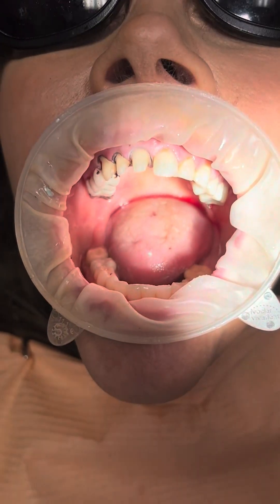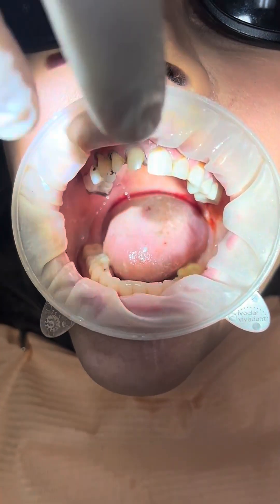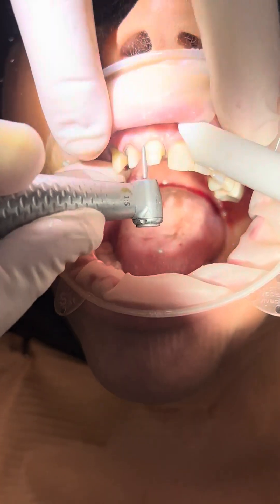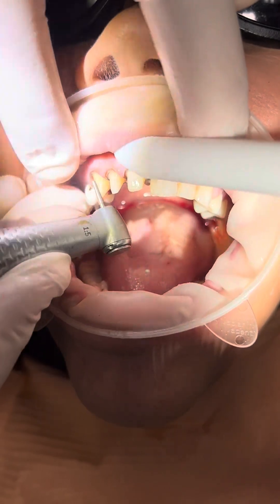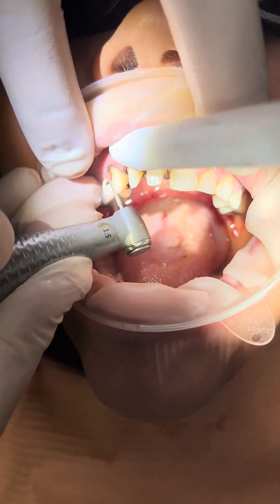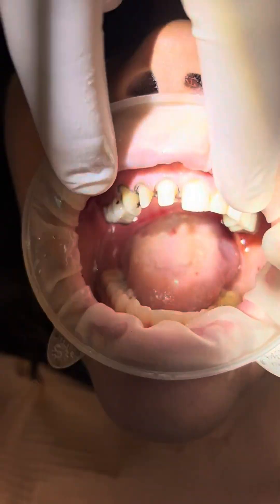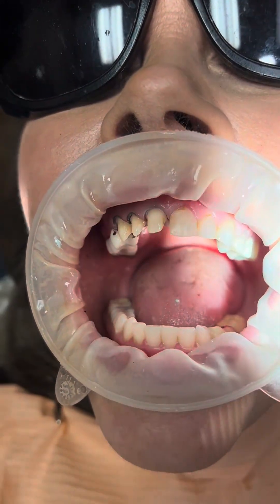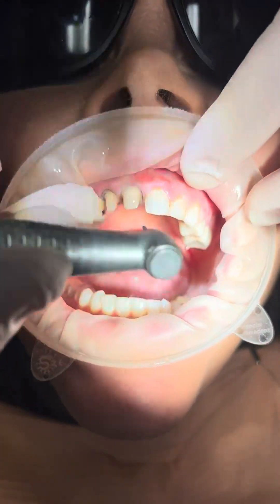I'm going to use a red stripe number 018. I just have a little more roll to set up here so I don't have enough room yet. We like the Brassler super coarse diamonds, just round-end diamonds. This is a 016 Brassler diamond.